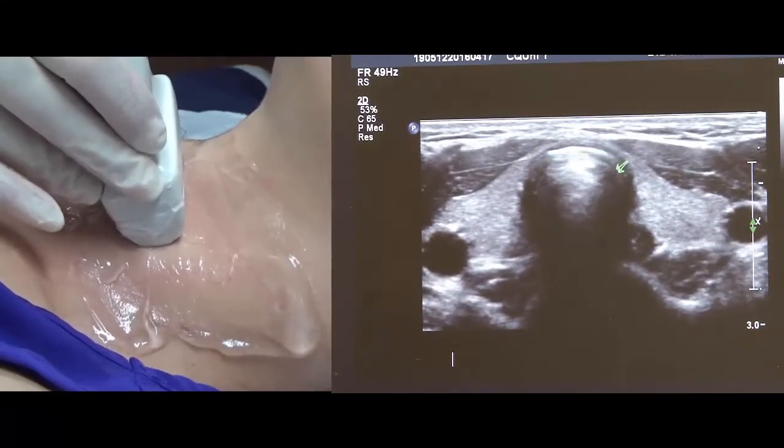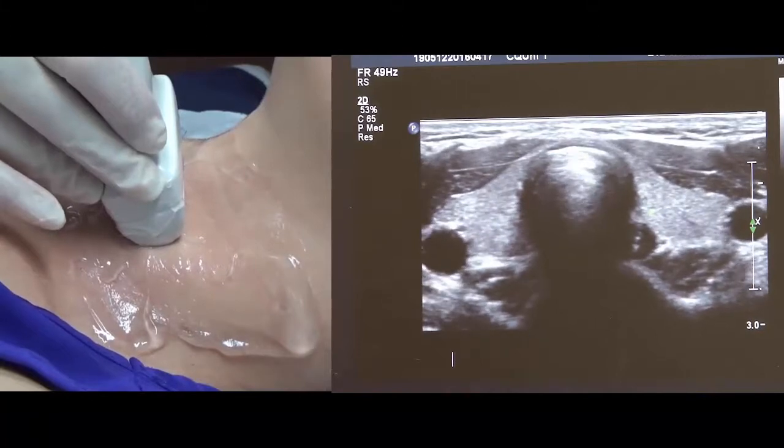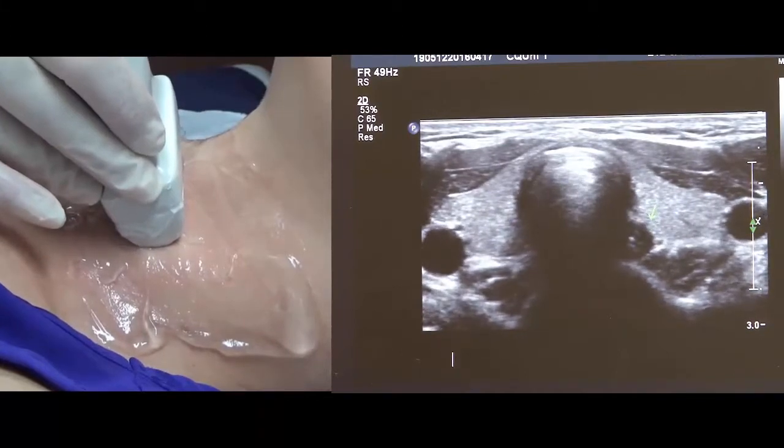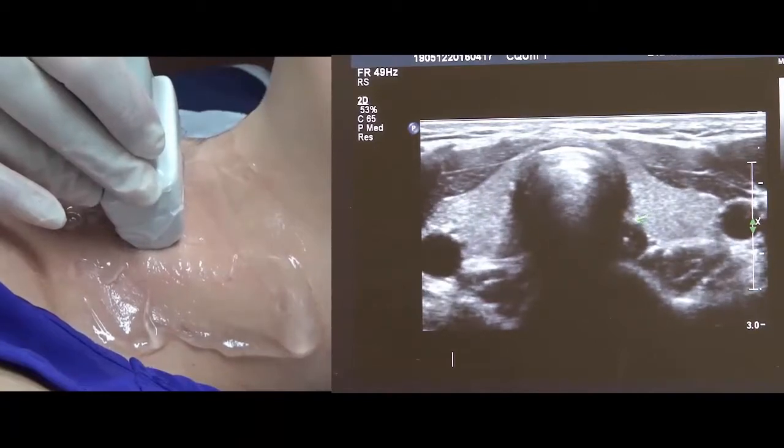Here we have the tracheal rings, so we can't see anything in there because of the gas interface. And then here we have the esophagus, always going to be on the left-hand side. Make sure that you don't mistake that for pathology. You can see it's quite hypoechoic, and it always is going to sit tucked in close to that tracheal region there.